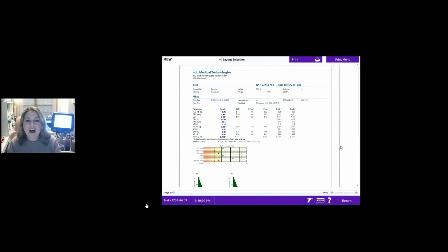There we go. Up in the upper left-hand side, you'll see that I do have the multiple breath washout only report selected. But again, if you are doing a full PFT where you're doing spirometry, SVC, DLCO, multiple breath washout, there are 2 different summary report options in your dropdown that you can select to show all of your tests on one single report.